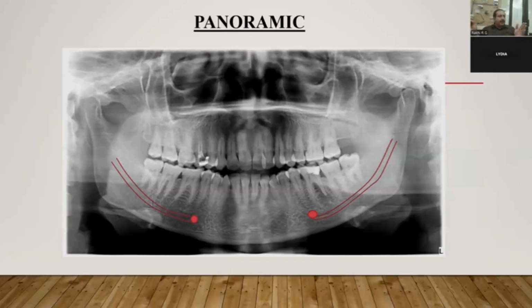As you move it wider apart, a little bit of effort will be sufficient to uproot the resistance side. Much of the force will be focused on the resistance side. As it comes closer and closer in the crowbar principle, even much effort will not have much effect on the resistance side. So if you bite on it hard also, the chance of uprooting the implant will be less.